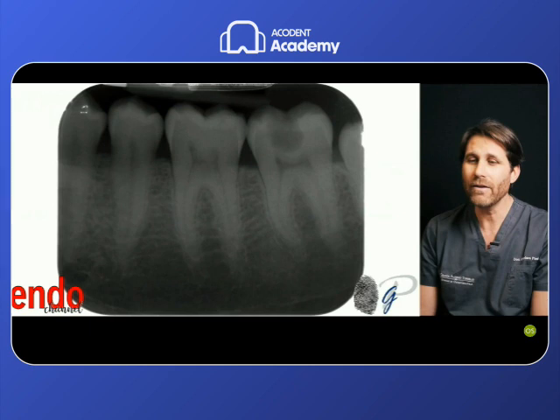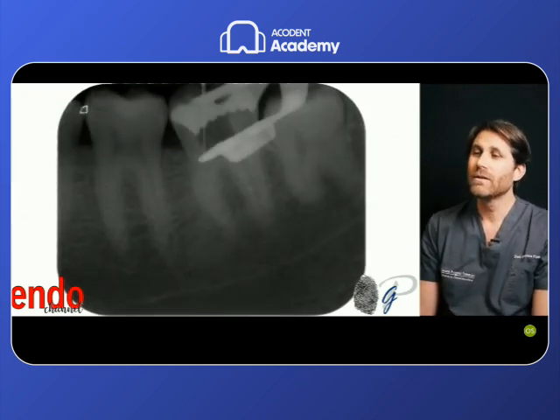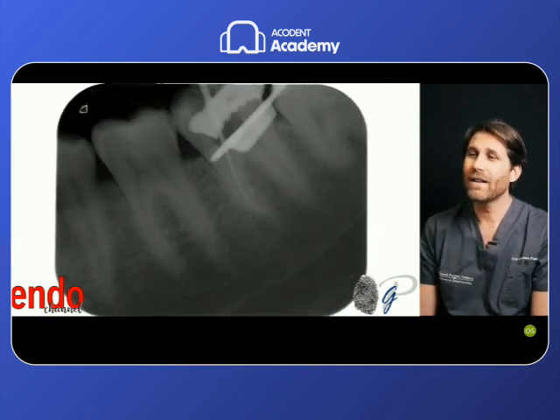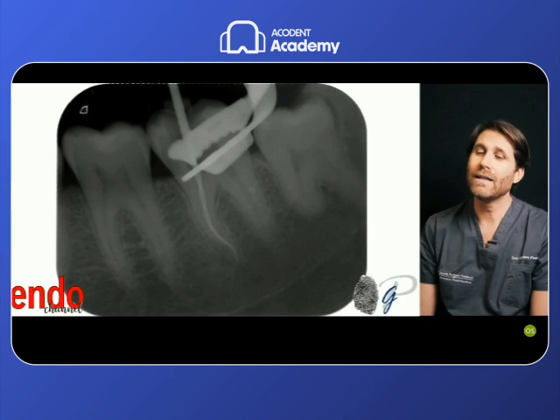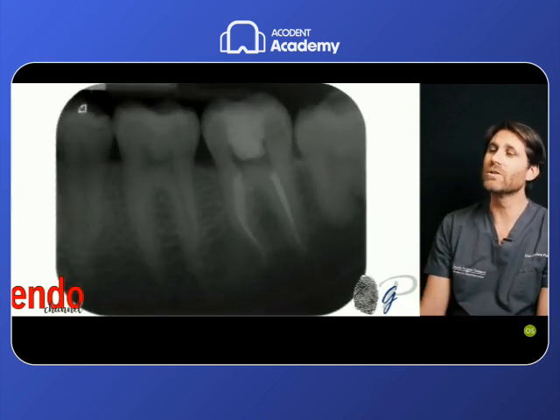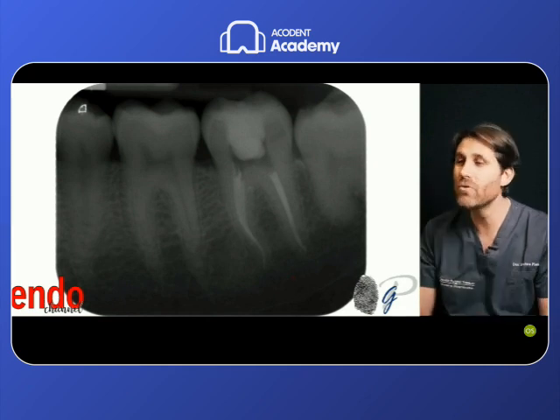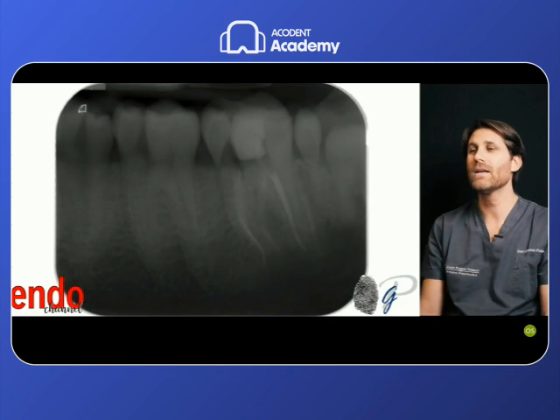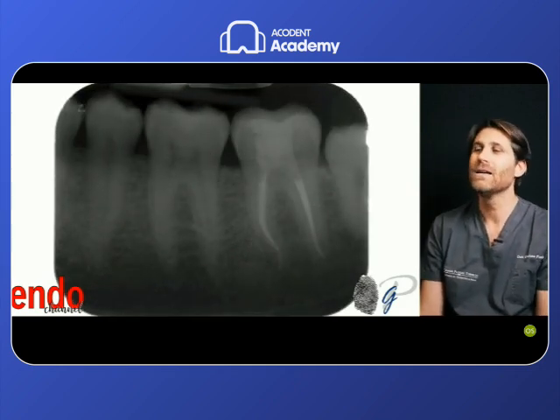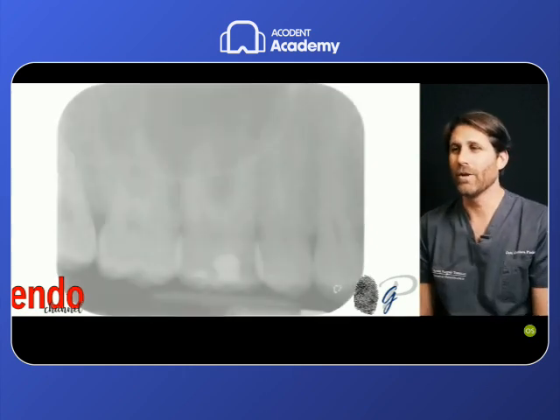So in this case, very tight canals, double curvature: a scouting small glide path file in the middle, and a final reciprocating file to scout these double curved root canals and to have a smoother advancement towards the apex, a smoother enlargement of these root canals that helps us to maintain a better anatomy of these root canals.